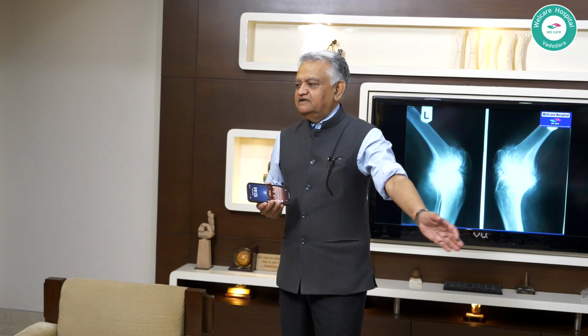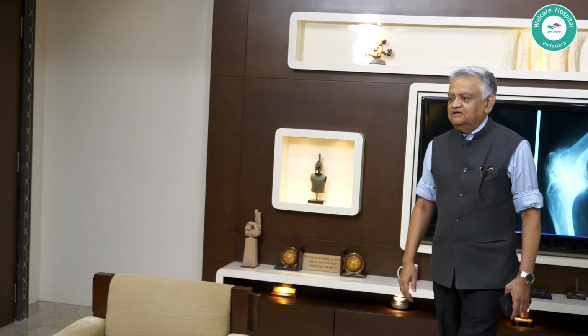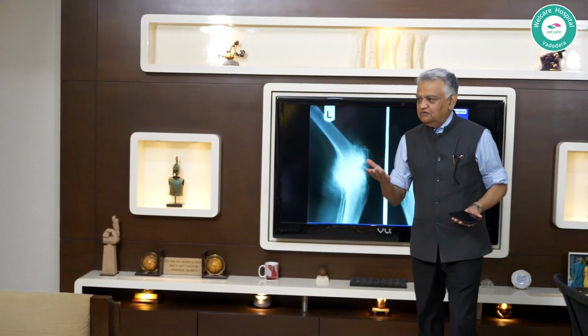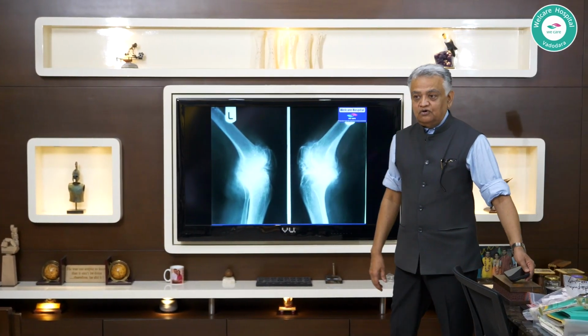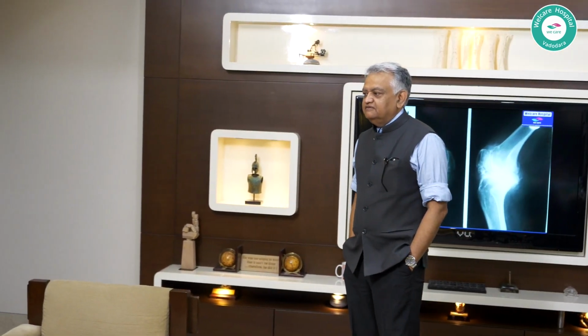I am pretty sure you will get it right every time within 1 degree or 2 degrees max. And it's already well proven in literature that up to 3 degrees it doesn't matter in terms of long-term survival of the construct. So this is a good game to play and become confident about your ability to see these things.